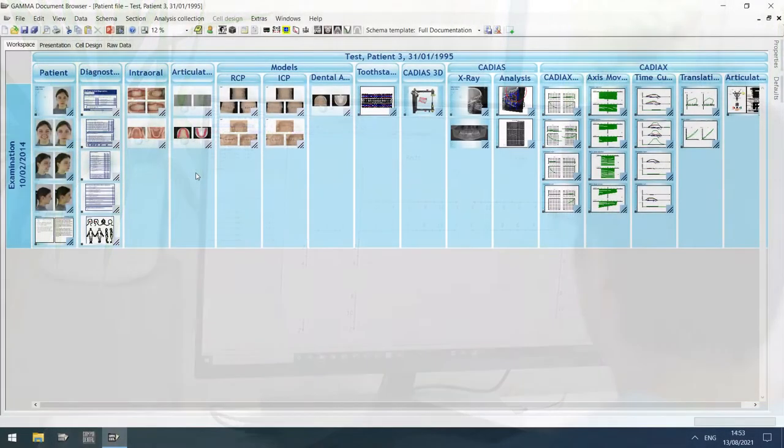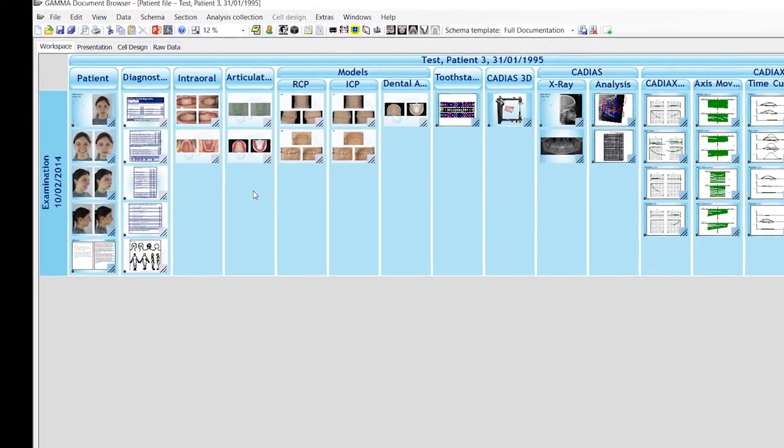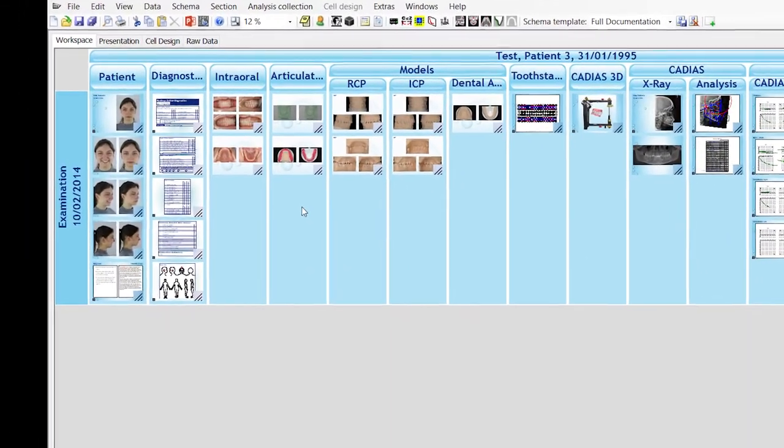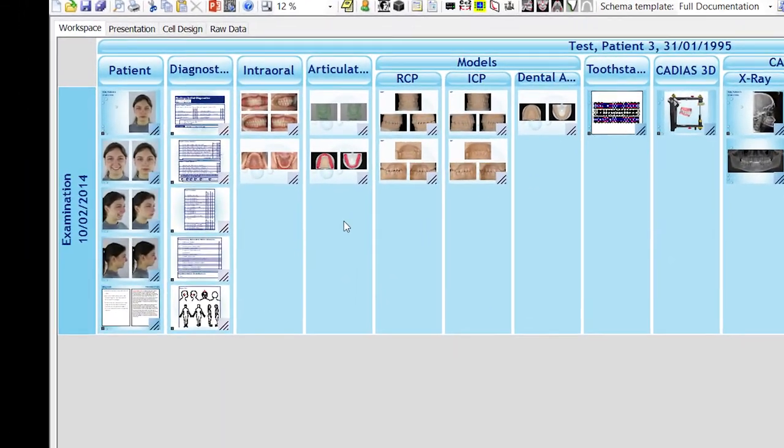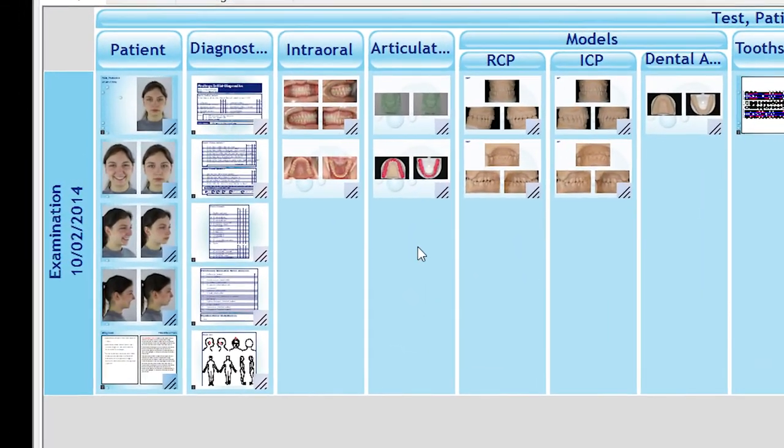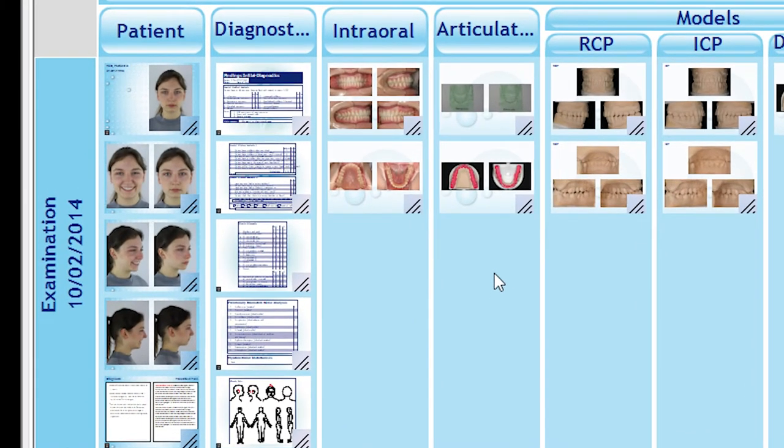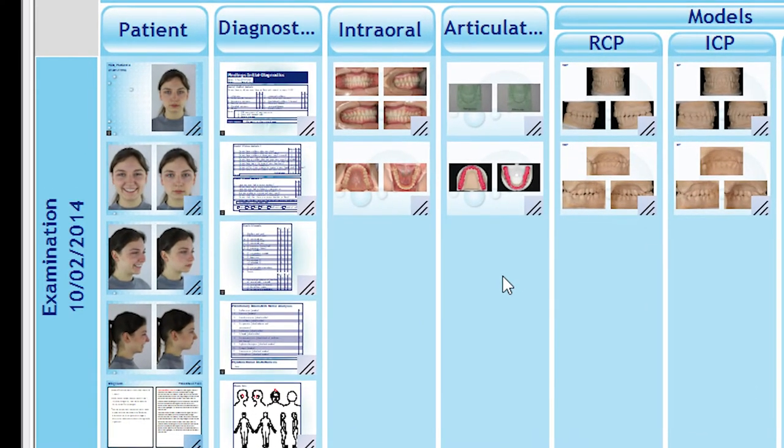Thorough photo documentation is an essential part of any well-documented patient case. Gamma Document Browser allows you to import and keep all pictures taken during the course of a treatment, displaying them in dedicated data areas of the workspace.